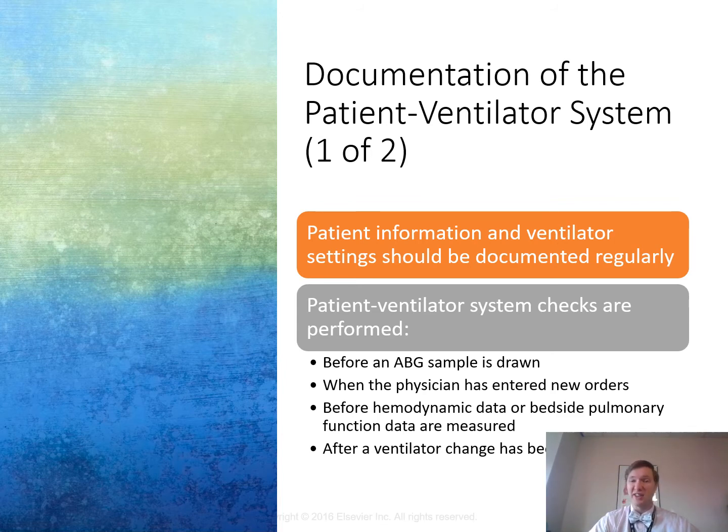What ventilator day are they currently on? How many days has this person been on the ventilator? In addition, when was the ventilator set up, the OVP, right? Patient information and vent settings should be documented pretty regularly when they're on vent support.